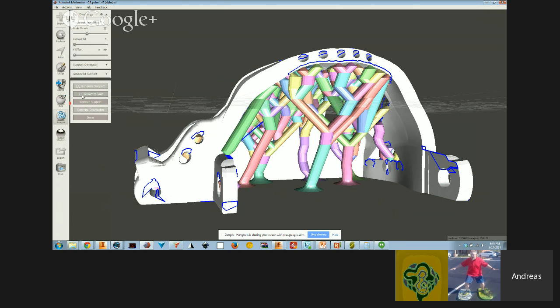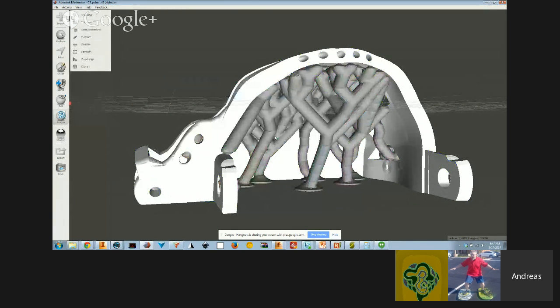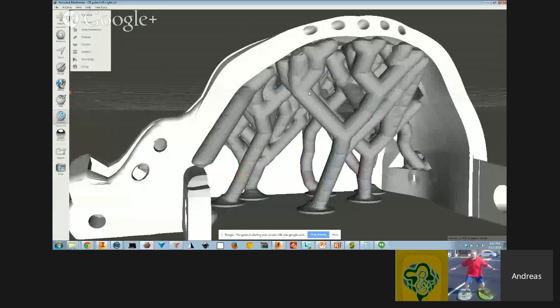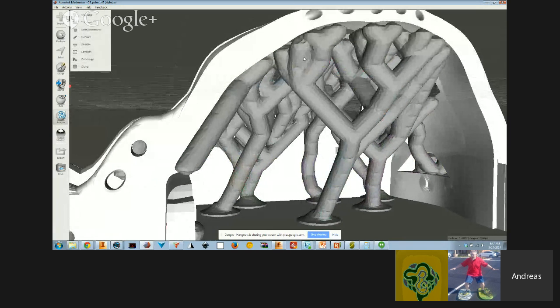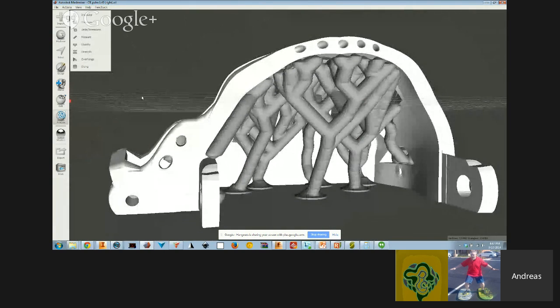The operation here was convert to solid, and here I can just say new object. What it does is this make solid operation, which we introduced to Meshmixer a couple of releases ago. It's kind of like a voxelization of all of the support, and where some support runs into each other, it becomes more like one object. You can see how it gets more like a cloud rather than individual cylinders. The cylinders are more supporting of each other, and that's a pretty critical step that we're finding, and we're going to make that the default going forward.